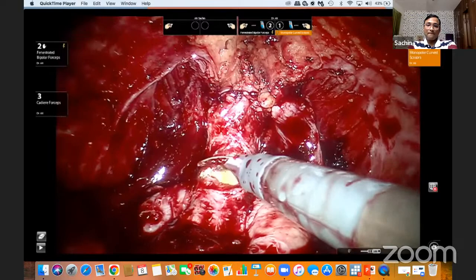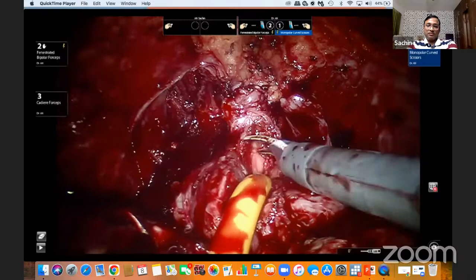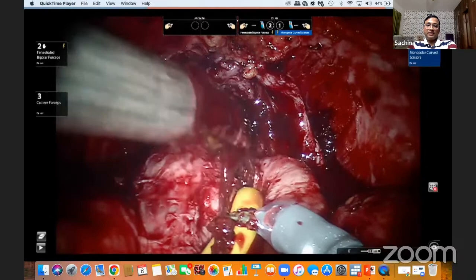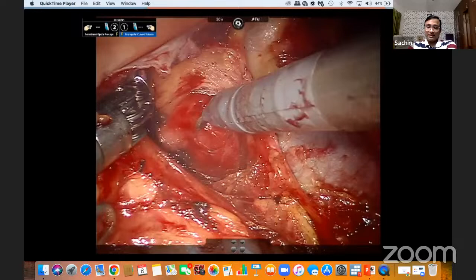So it's important to keep it a closed system, because urothelial carcinoma, as we know, has a tendency to seed. So cut the catheter, urethra. As I'm planning a new bladder, I'll be taking a prostatic urethral biopsy for frozen. How much time will it take for frozen to come? Half an hour. So the specimen is bagged. The important thing is to always bag the specimen when we are doing radical cystectomy.